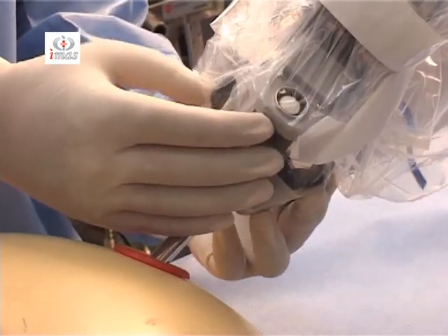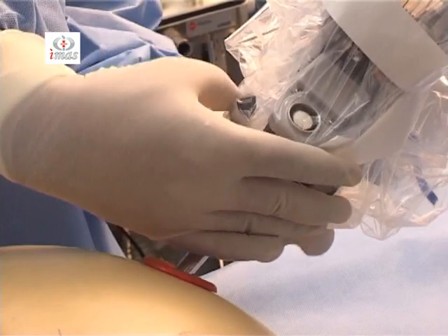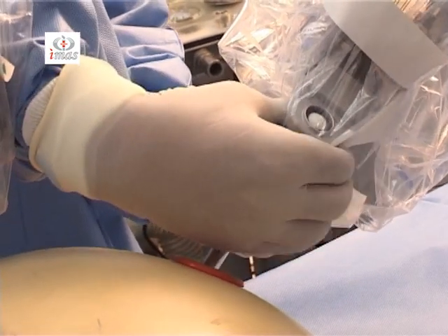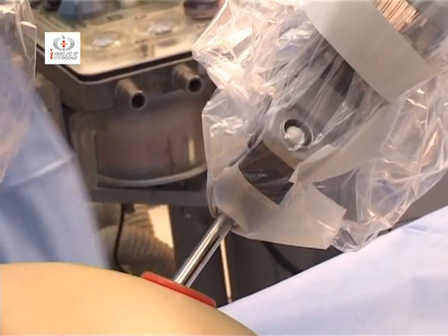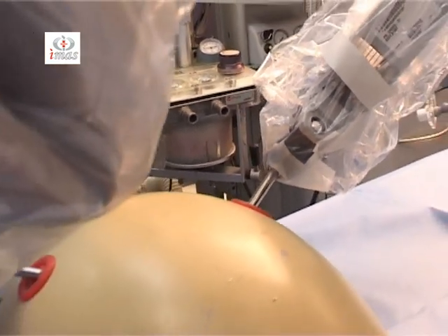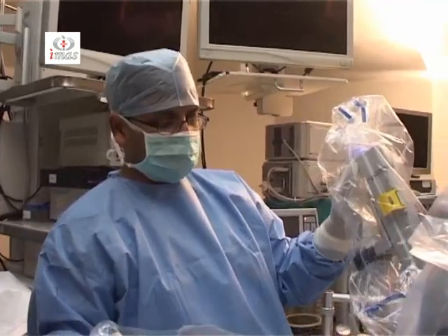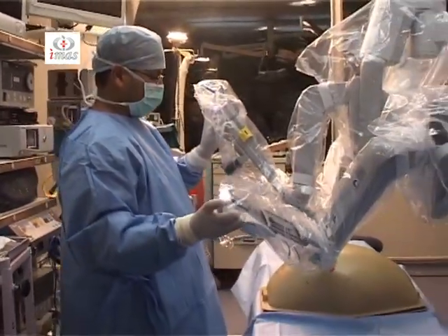And the port is placed inside the arm once it is parallel. Only if the arm is parallel, it will be docked nicely, otherwise you can break these clips. So this is again docked. So the docking is complete, and now you can see that these arms are well separated from each other, and there will be no external arm clashing even if I move them to a great extent.